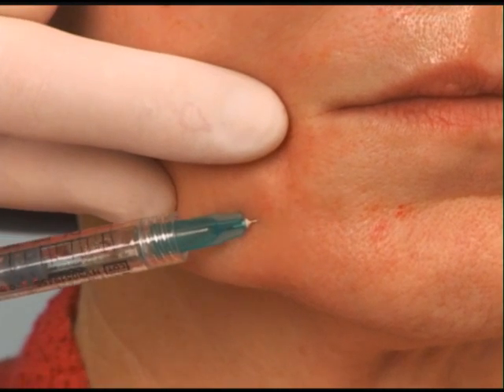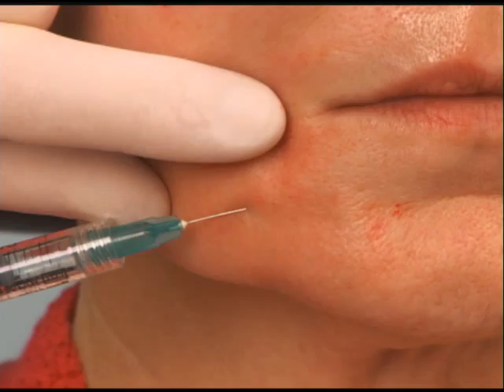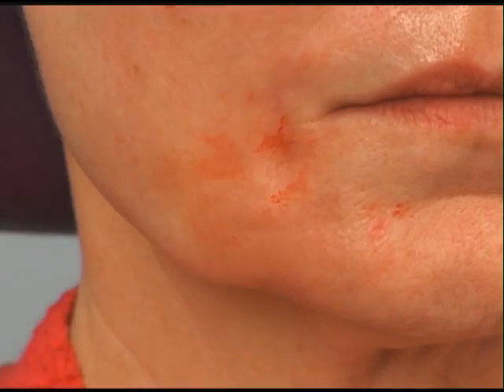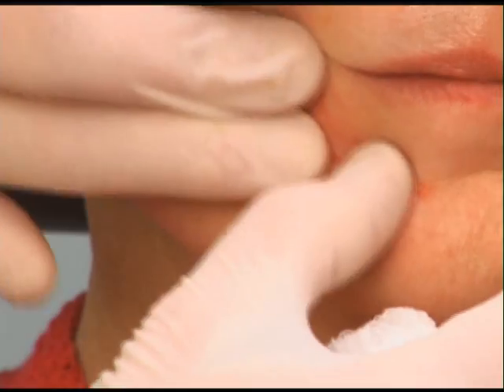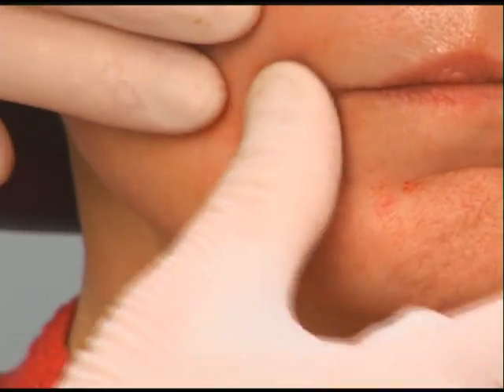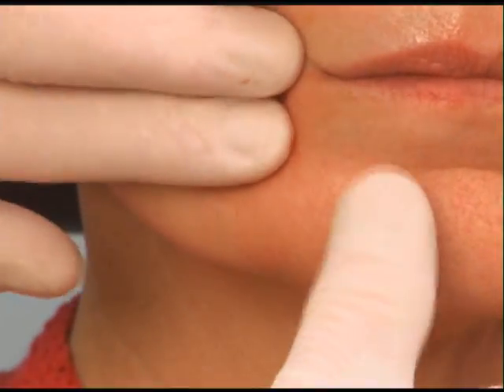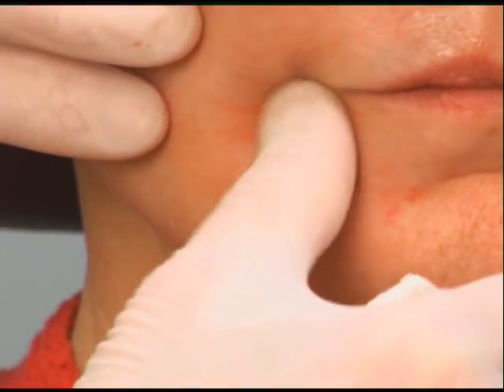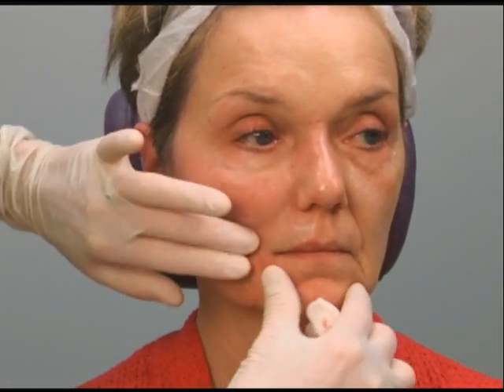Like always, I just inject slow because it hurts a little less. Then I mold it. You can always go on the inside too — pinch it and make sure it feels smooth on the inside. Or press hard against the teeth to make sure the inside doesn't have any bulge that will be distracting.